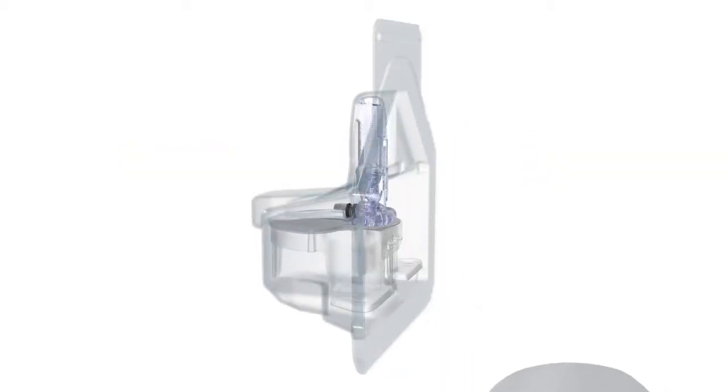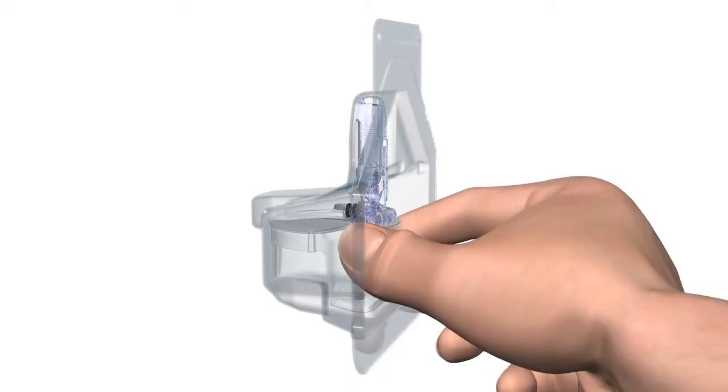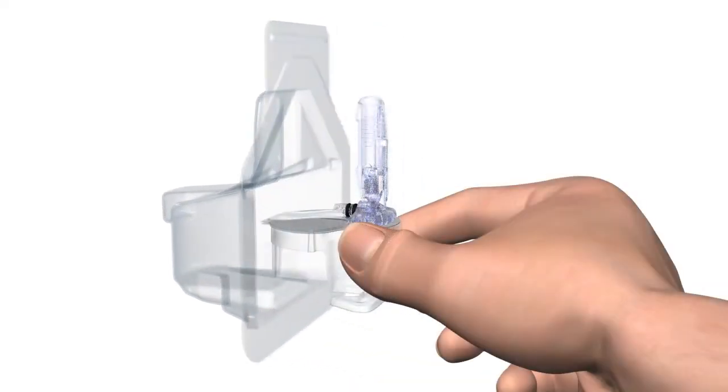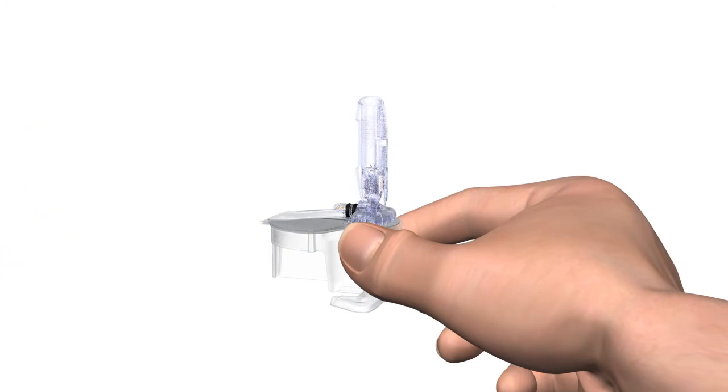Open the Enlight Glucose Sensor Package. Remove the sensor from the package by holding the plastic pedestal. Do not hold it by the sensor or needle housing as this could damage the sensor.